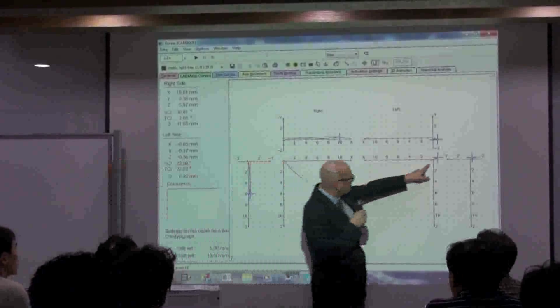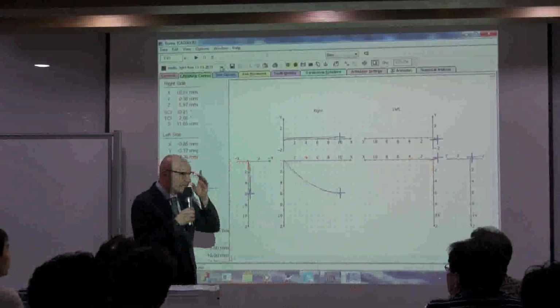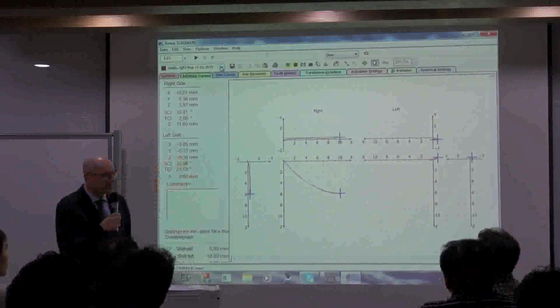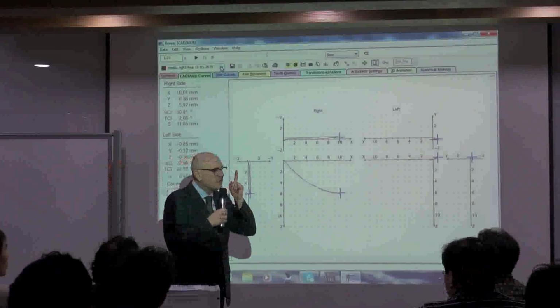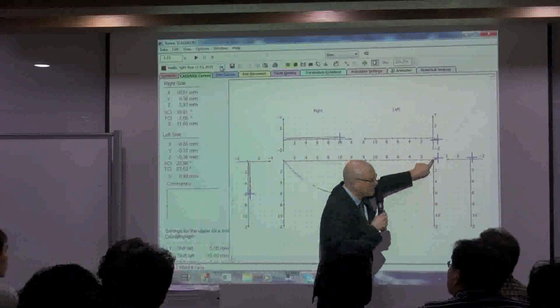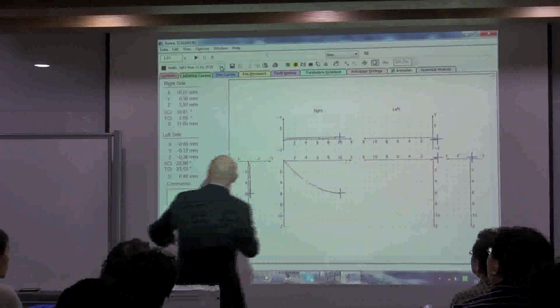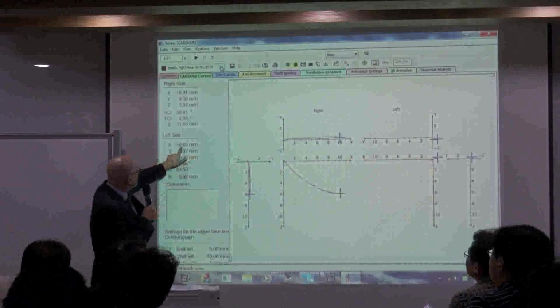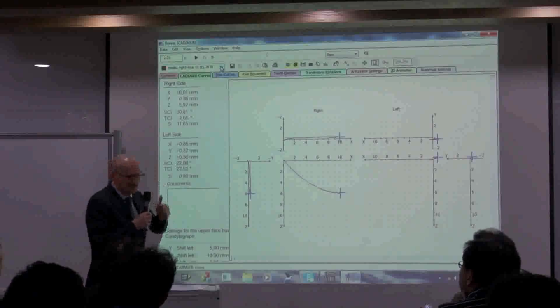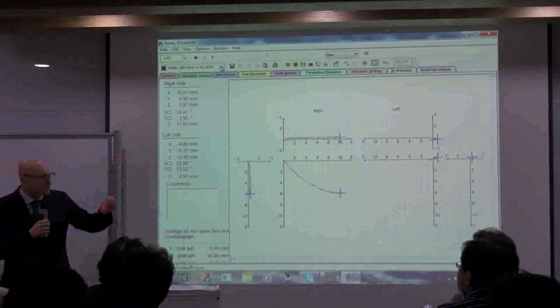And then we look to the other joint. Look at this one. This is the balancing condyle. The working condyle. What is the regular movement of the working condyle? Any idea? Usually, ideal is rotation along the vertical axis around the 0 point. The 0 point of the coordinate system is RP. Here, put the cross here, we can check: minus 0.85 cranially, going up on lateral protrusion. And backwards. Yes. Going up and more backwards.